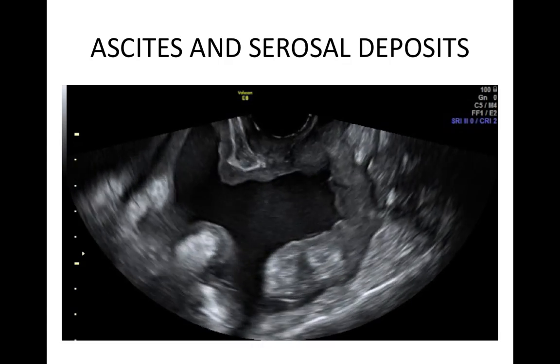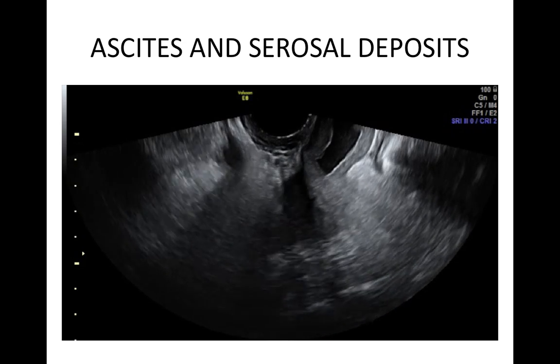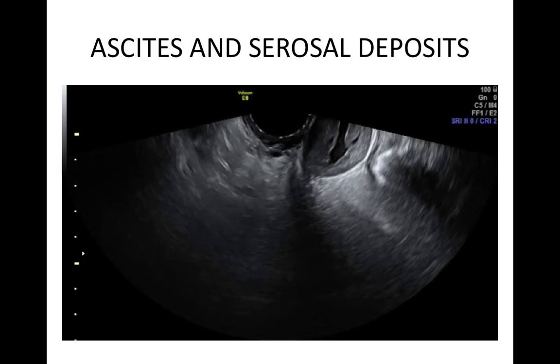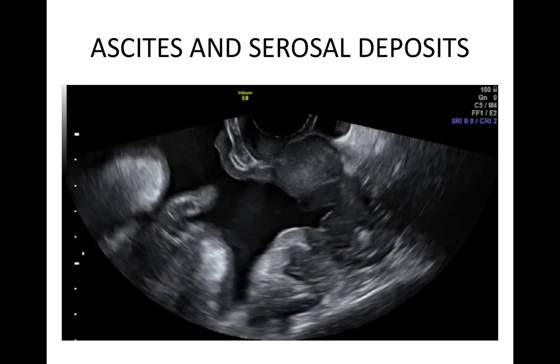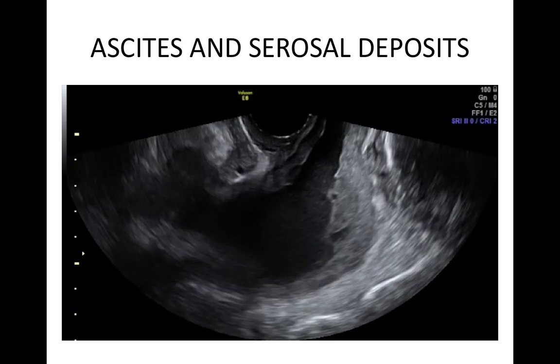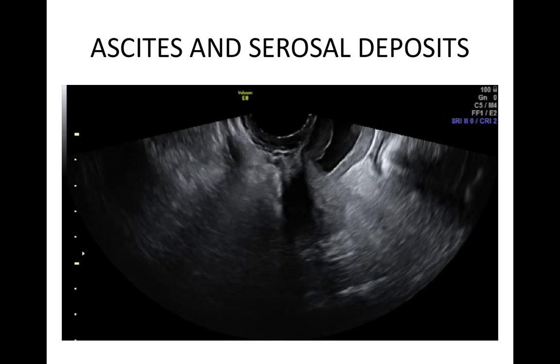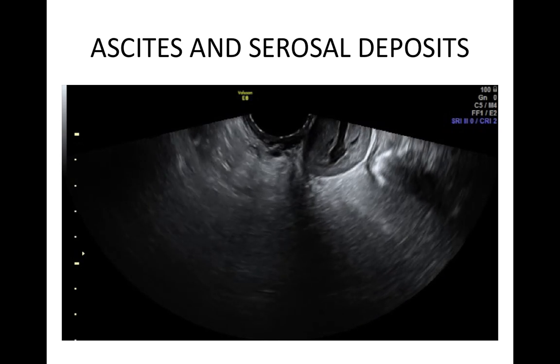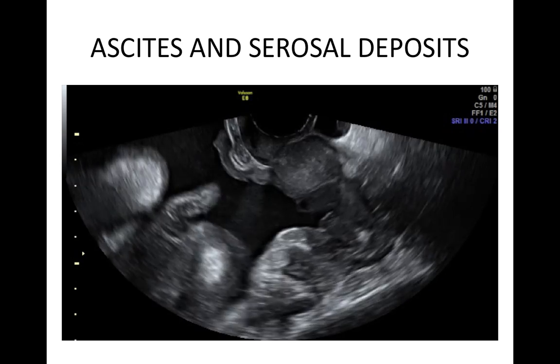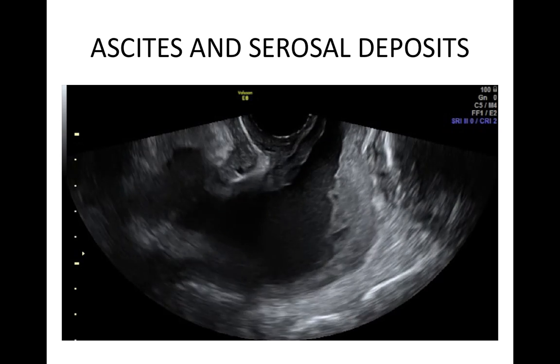When you have scanned a mass and think it might be malignant, it is important to look for evidence of spread such as ascites, serosal deposits and an omental cake. Here is an example of ascites and large serosal deposits as plaque in the pouch of Douglas.